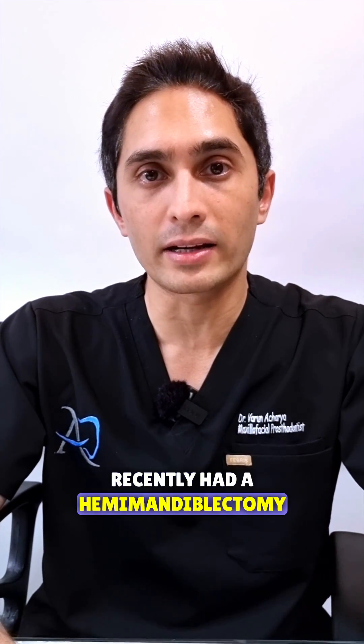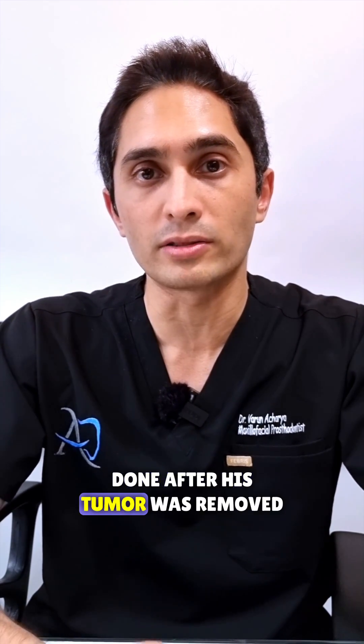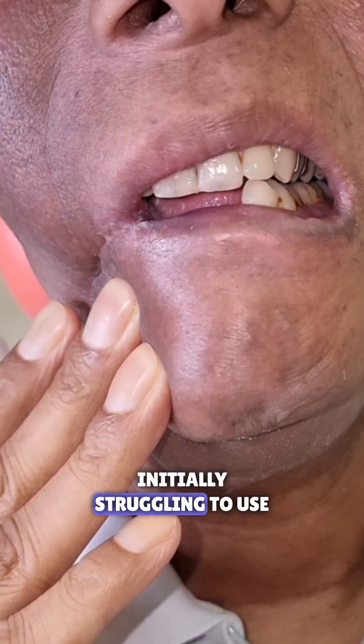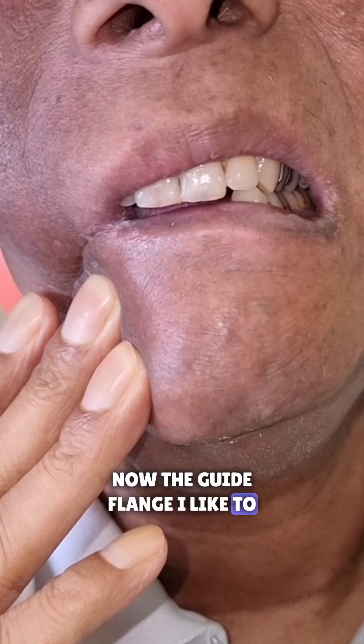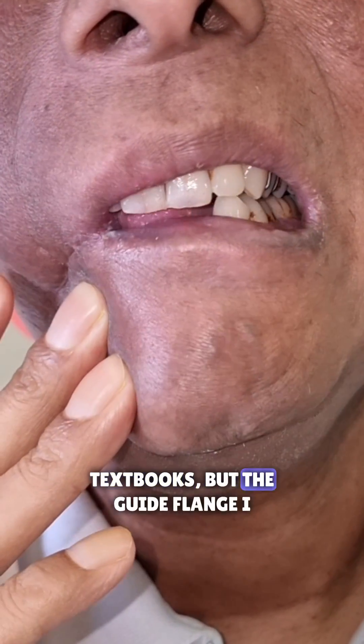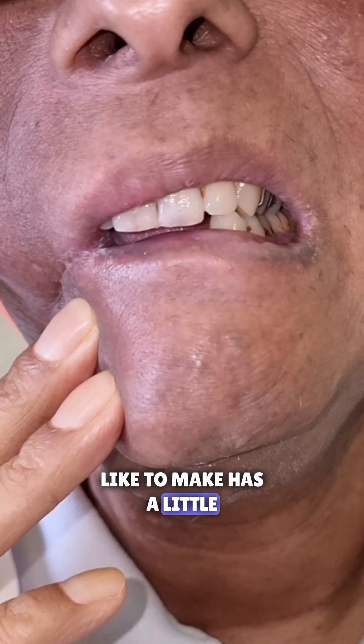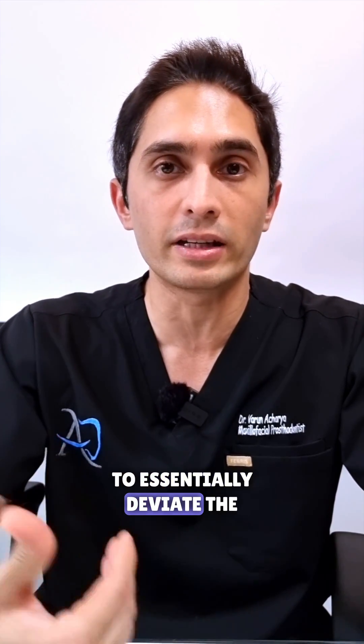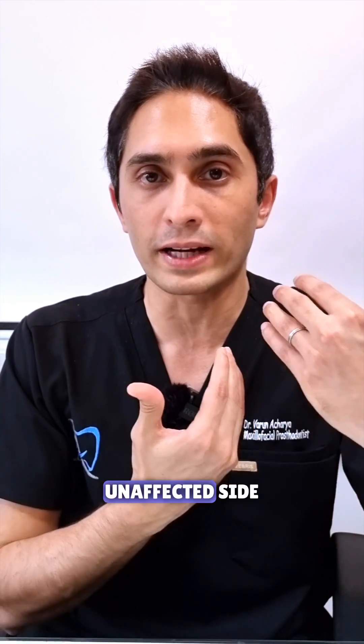Here's another gentleman who had recently had a hemimandiblectomy done after his tumor was removed. You can see he's initially struggling to use the guide flange. The guide flange I like to make — and I know there are so many types in textbooks — has a little extension on the palate. It's always made on the maxilla, with nothing on the mandible, to essentially deviate the unaffected side.